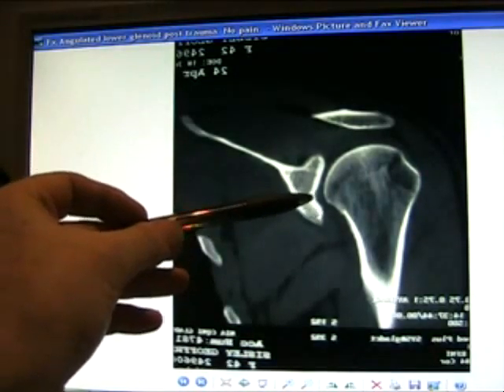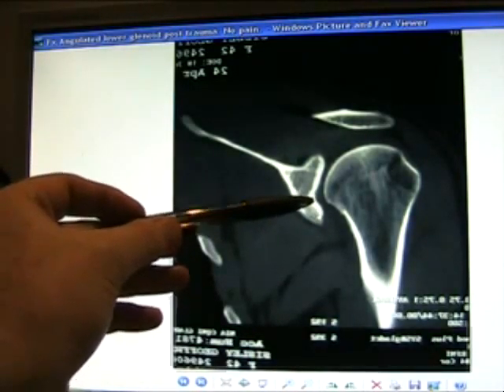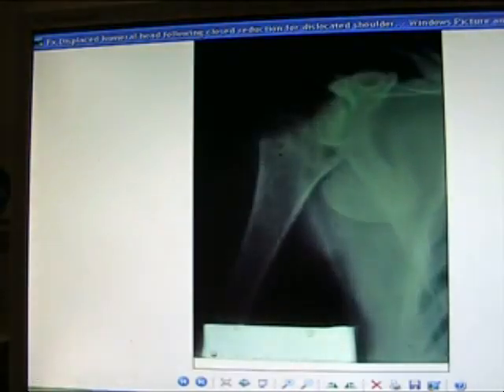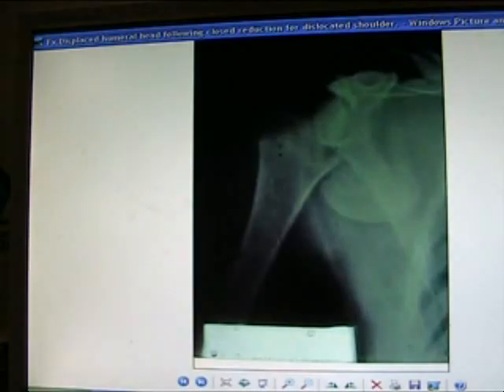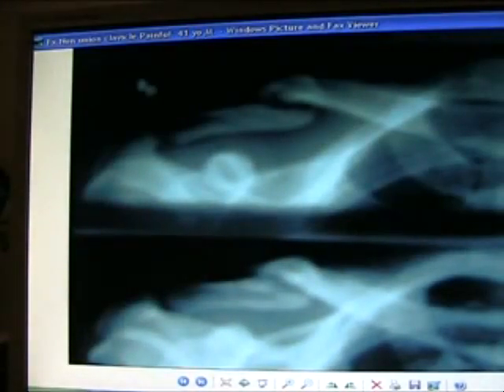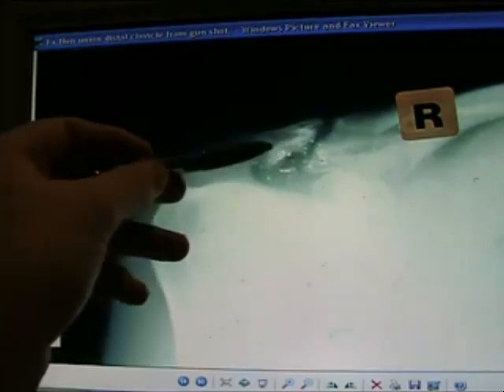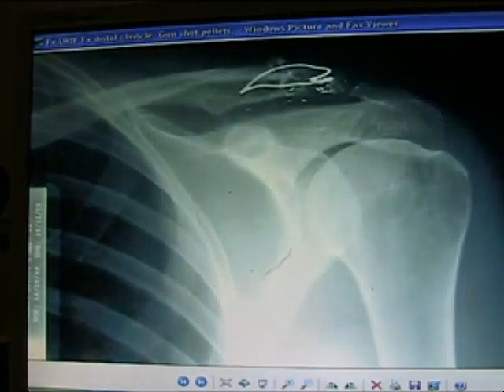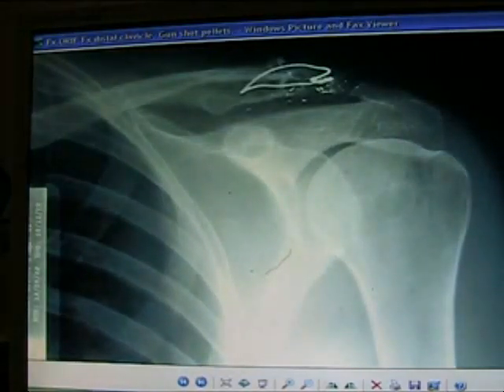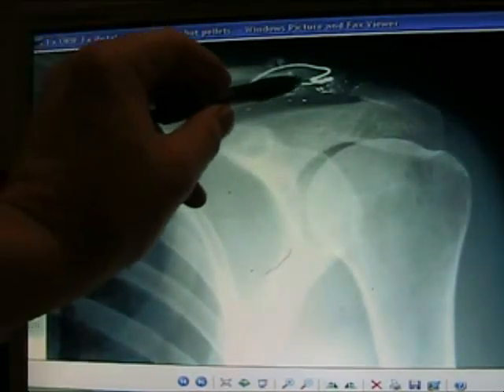Fracture of the lower angle — an angulated lower glenoid from a previous fracture, not causing the patient any problems, so it was left. Fracture of the mid-clavicle with non-union. Gunshot fracture of the distal clavicle — will require bone grafting. Commonly fractured mid-clavicle required bone grafting and fixation.